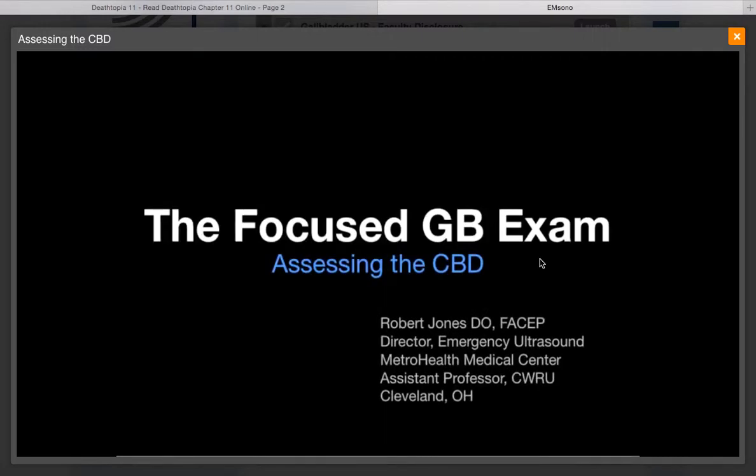I'm Dr. Robert Jones, and welcome to the Assessing the Gallbladder Common Bile Duct lecture. Although evaluation of the CBD is not included as part of the intro gallbladder module, a brief intro to evaluation of the CBD is provided, since attempts to visualize the CBD should be made on all the gallbladder exams you perform.